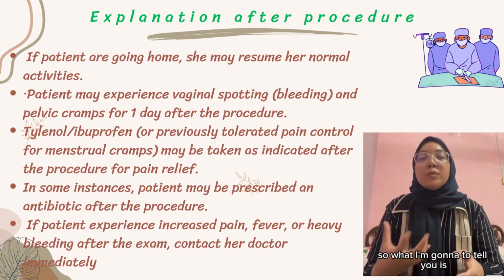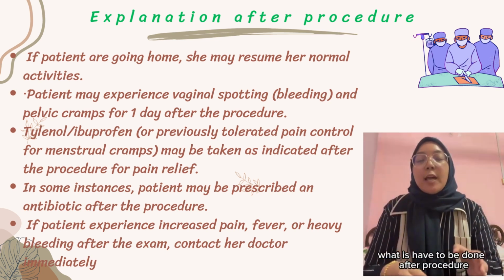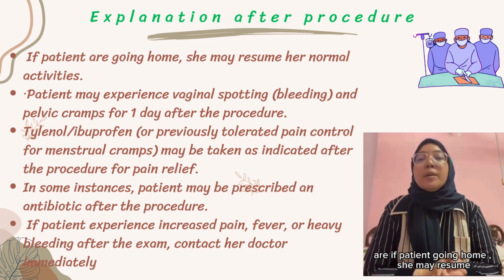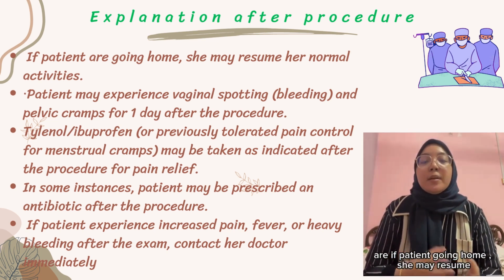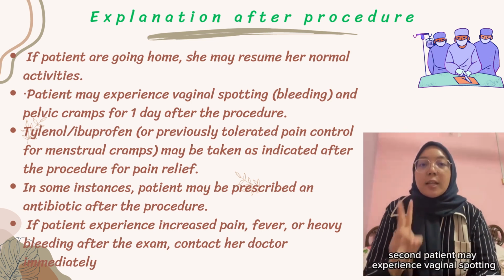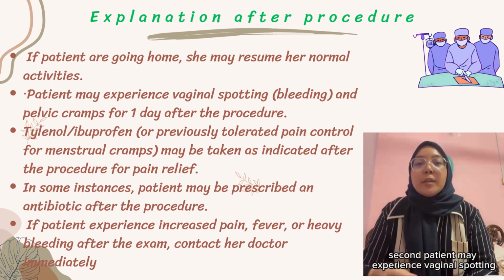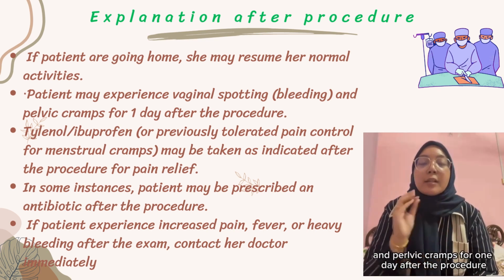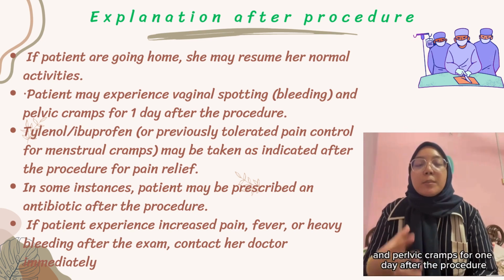So what I'm going to tell you is what has to be done after the procedure. If the patient is going home, she may resume her normal activities. Second, the patient may experience vaginal spotting, bleeding and pelvic cramps for one day after the procedure.